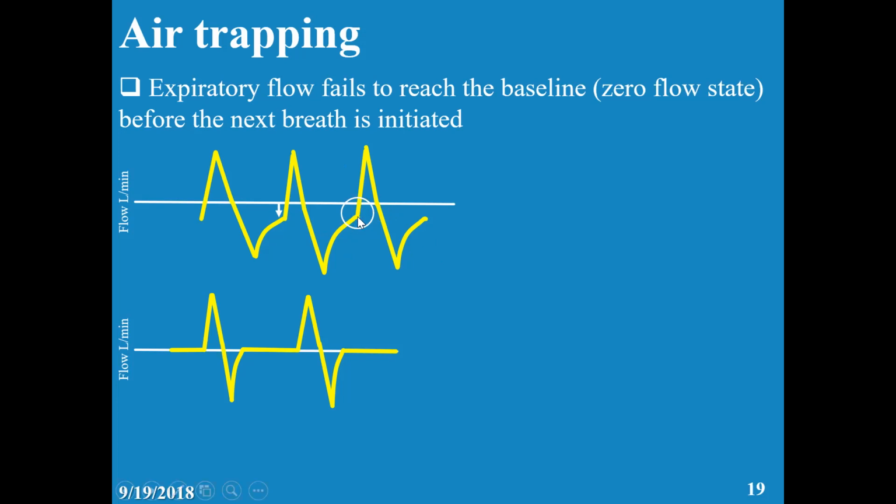You give more time for the expiration to go back to zero. So you need to push this a little bit away. How do you do that? By prolonging expiratory time or giving a bronchodilator. Is that clear? Question? Yes, it's clear.